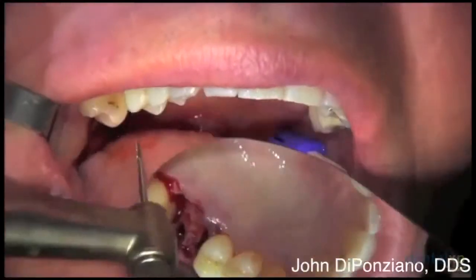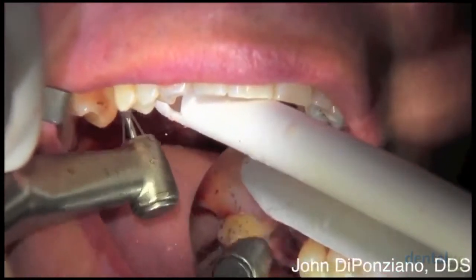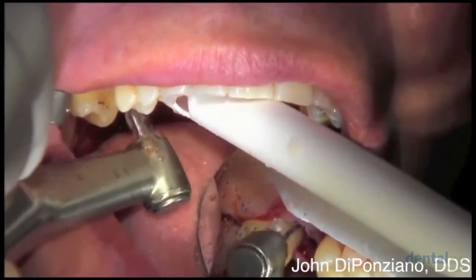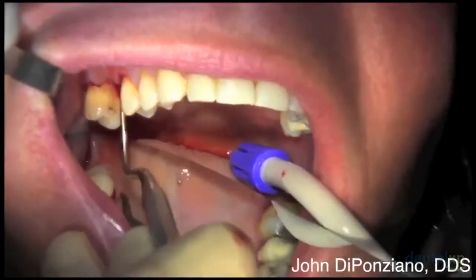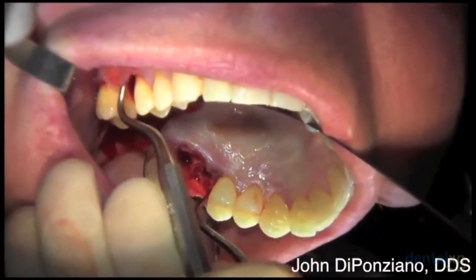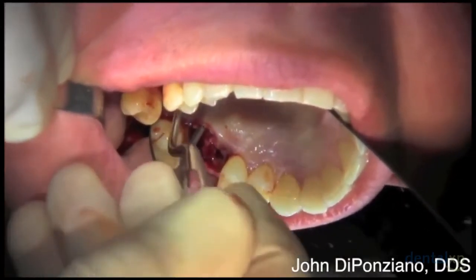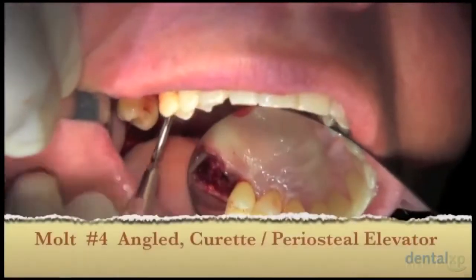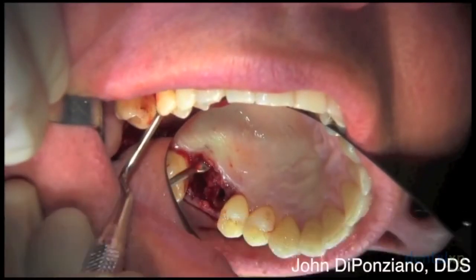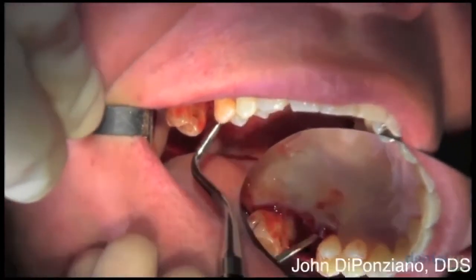That same Comet burr is very smooth, so it's used to smooth down and plane the root. There's a mesial defect on the number two molar, so this is also cleaning out that defect to get down to sound bone. We use that same number two angle to release the periosteum on the facial flap, and on the palatal flap we use a number four, which has a little broader blade, to undermine the tissue and release the periosteum.